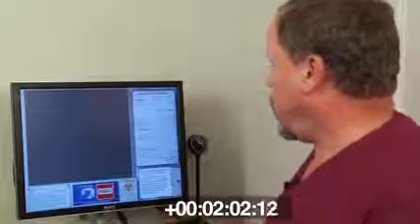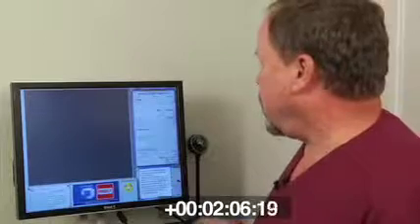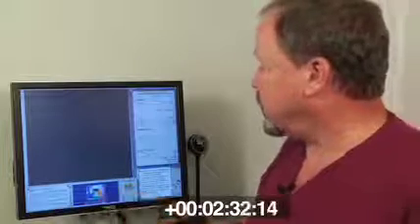So right now we're just waiting for that. And in the other room where the scanner is, it's actually spinning around and doing some calibrations while we wait. And on our patient, we'll get him over here in a minute, and we'll put a lead shield. We use a front and back lead shield. Scatter's not real high, but within the ionizing radiation, it makes sense to keep it to a minimum dose on any patient you have. So right now it's done with the calibration, and it's asking us to seat the patient.